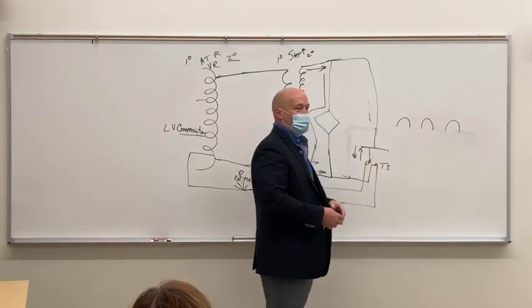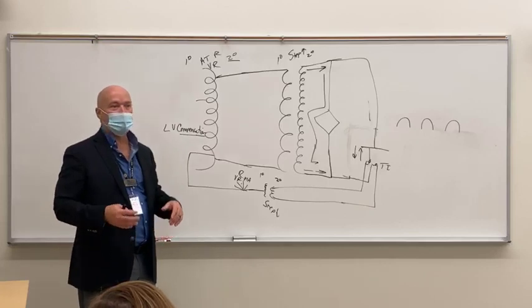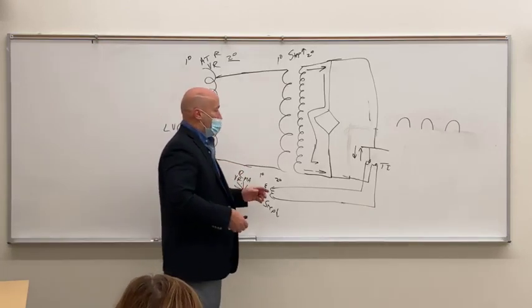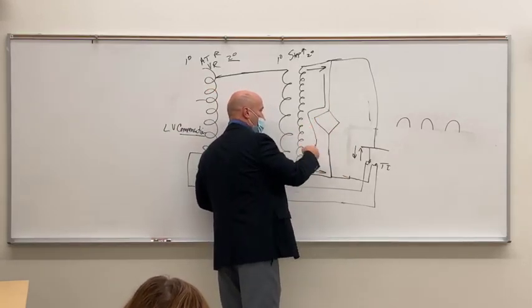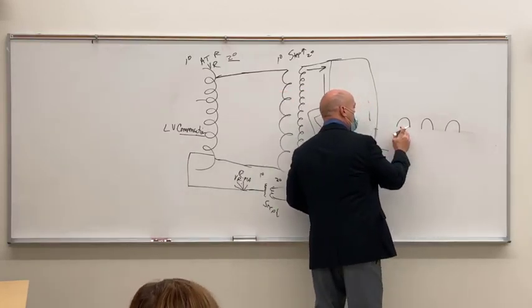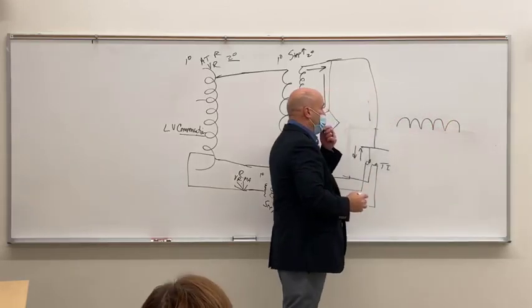So the x-ray tube actually does this. That's what you call a self-rectified unit. Again, unless you're working in a dental office, you're never going to see those. Even our Panorex units don't use that. Our Panorex units run the alternating current through a rectifier bank so that what we have is that plus the negative side flipped up, okay?